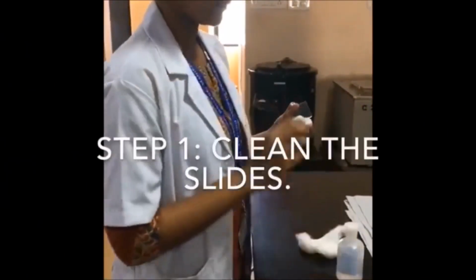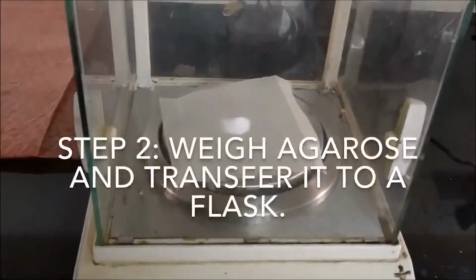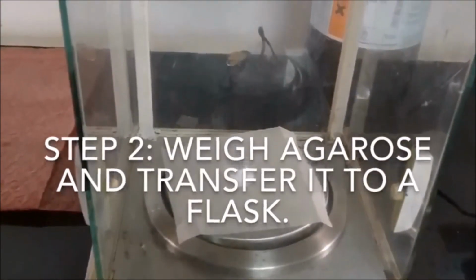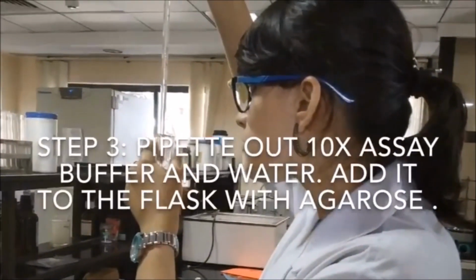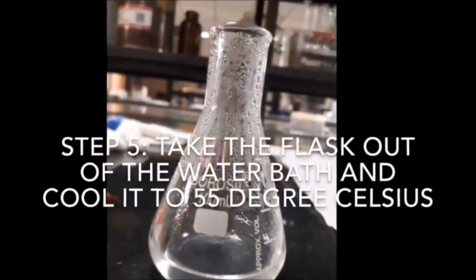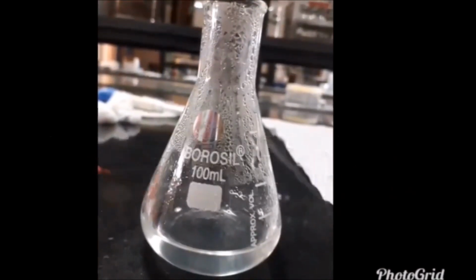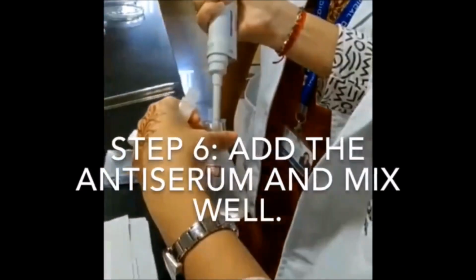At first, the slide is cleaned with alcohol. Agarose is weighed and transferred into a flask. Step 3 involves pipetting out 10x assay buffer and water and adding the agarose into the flask. The agarose is made to dissolve by keeping it in a boiling water bath. Once the agarose is dissolved, the flask is taken out and cooled to 55 degrees Celsius. Step 6 involves adding the antiserum and mixing well in the agarose gel.